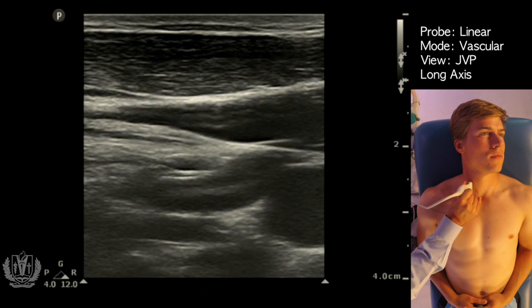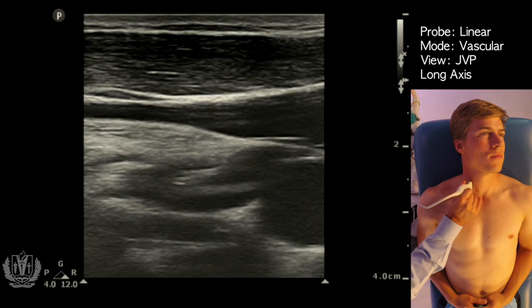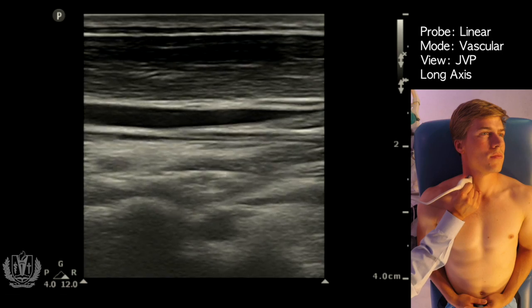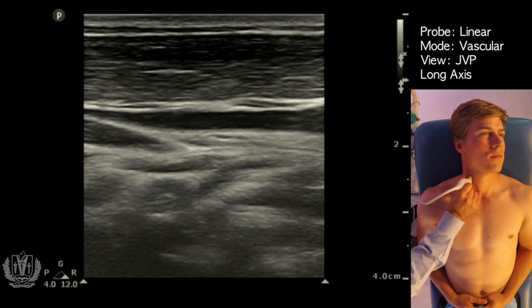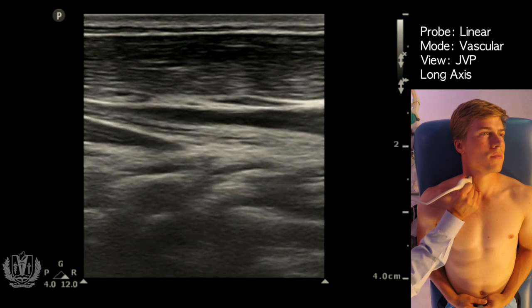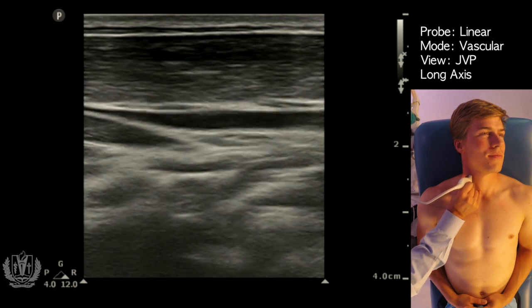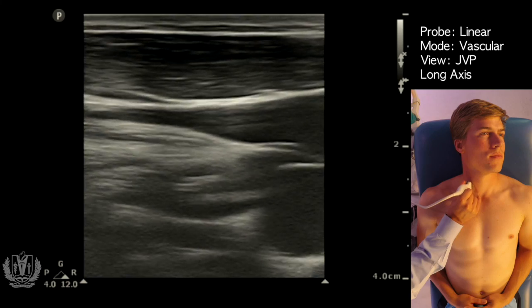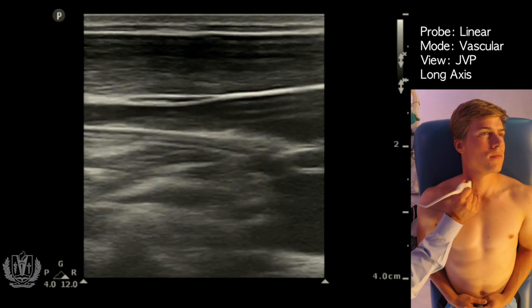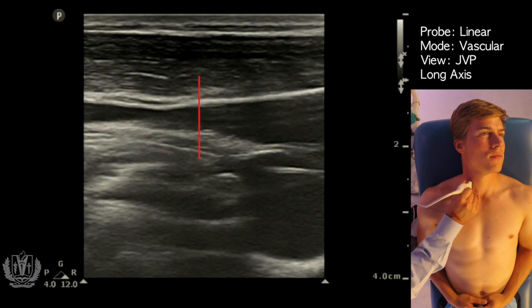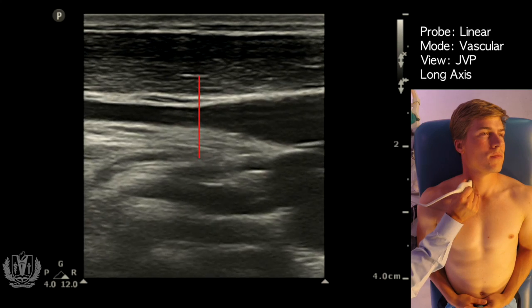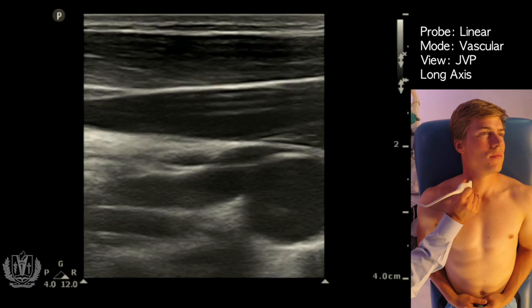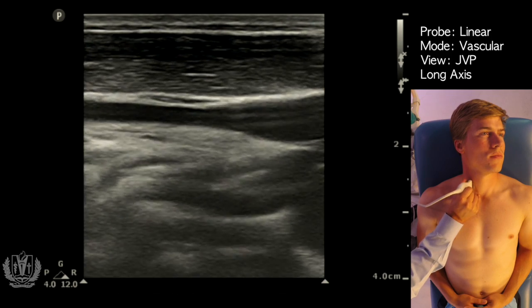To assess for jugular venous pulsation, you really want to get the long axis view and look for where it tapers down. It's not going to fully collapse 100% because there's still some flow going toward the heart. You want to see where it tapers — here in the middle of the screen is where the internal jugular vein really tapers, and you can call that your JVP. You can correlate that with your physical exam as well.